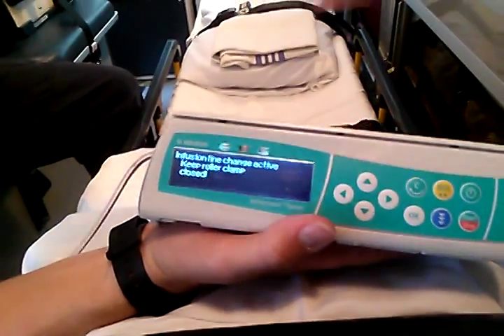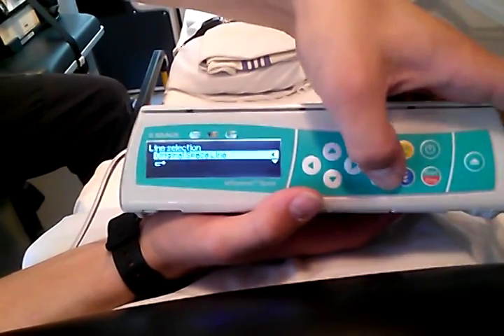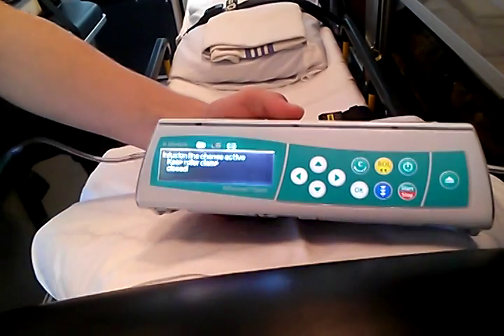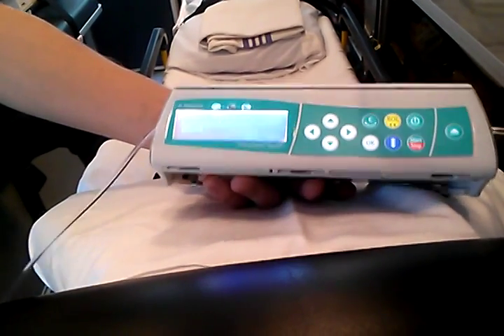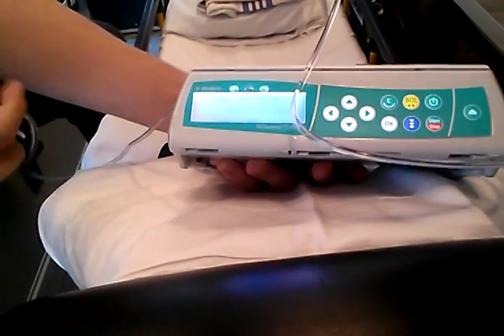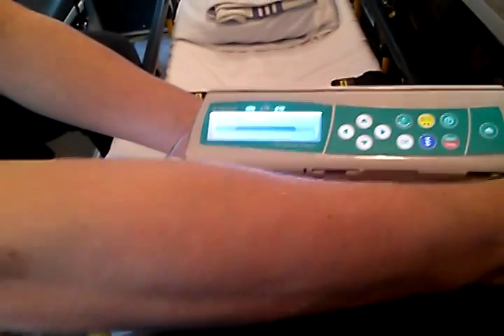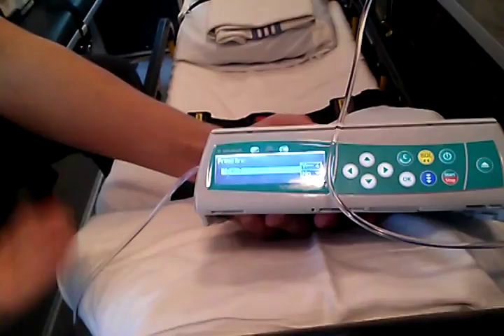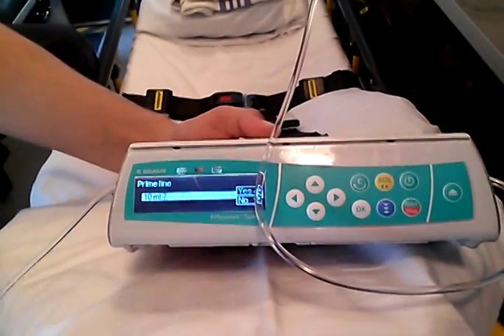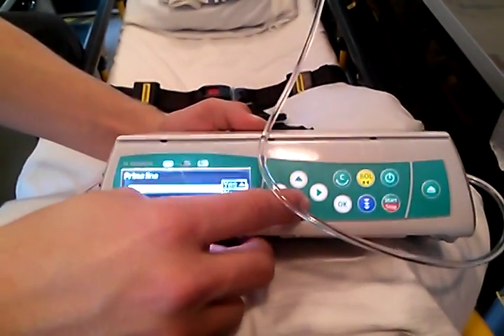At this point just follow the instructions on the screen. It'll ask you to prime the line — make sure your roller clamp is closed, which it should already be. Then it'll tell you to open the clamp. It'll also say to disconnect the patient before priming and ask if you want to prime the line. If you already bled the line through, there's no reason to prime it. If you do prime it, you're just pushing 10 mLs through a line that's already primed — you'd be over-delivering medication. So we're not going to prime the line.